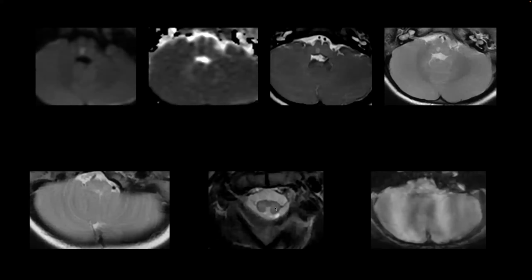See over here, if you see the areas, I don't know if you see my mouse. Probably medulla only, right? Yeah, that is the medulla only, and the lower medulla. But we are seeing something in the cord. Dr. Aiken has mentioned this part. That could be the cleft, but this part, if you see, it is bright, isn't it?